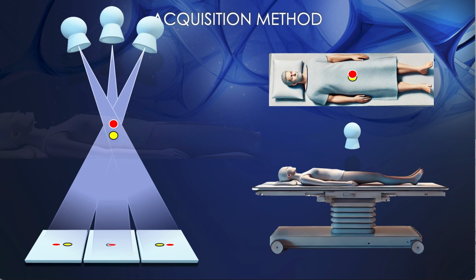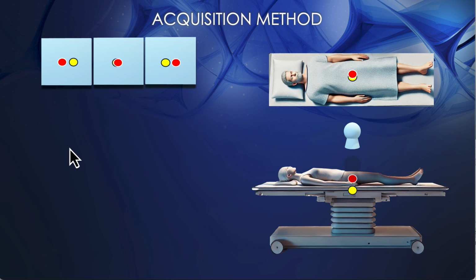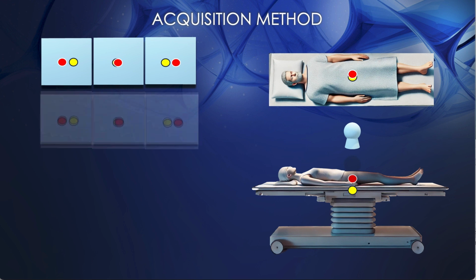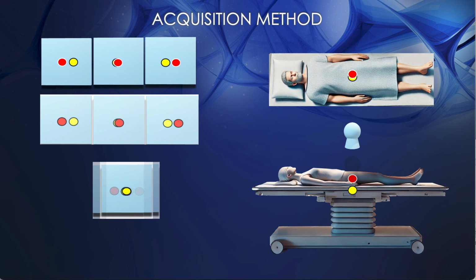And those projections enable you to separate those two objects because they are present at different depths. And then what happens is, because you have saved those images, those different images that I showed you, you can recombine them and shift them to an appropriate amount where only an object at a particular level superimposes upon itself, whereas objects outside of the level are essentially blurred away because they get reproduced at multiple locations.